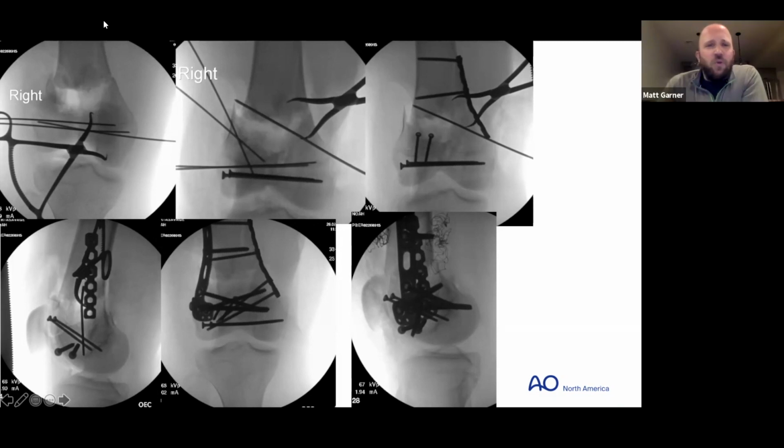Yeah, there was a question that just popped up on why not a locking plate with non-locking screws, and there's nothing wrong with that either. I think you could literally use almost anything in this situation. The pre-fabricated, pre-contoured condylar plates are fantastic, and 99 out of 100 times I would do that. In this situation, we went with something different. That's all.